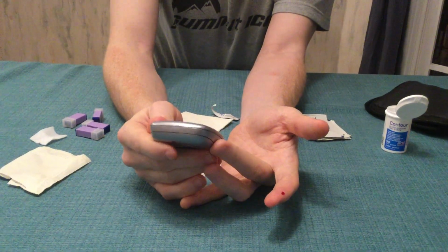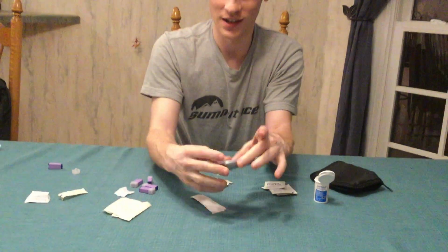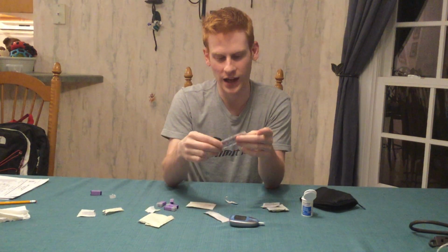My blood sugar is 120, which is not ideal, but I did eat recently, so that's within normal limits, so I don't need oral glucose. So I can wipe away the remaining blood I have and then put a nice Band-Aid on it.